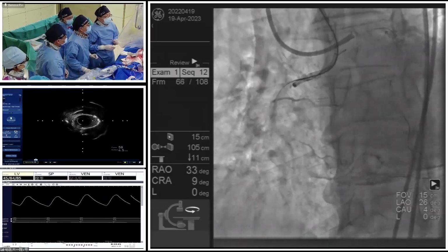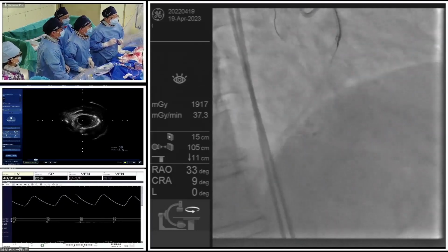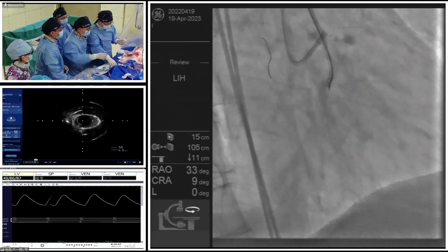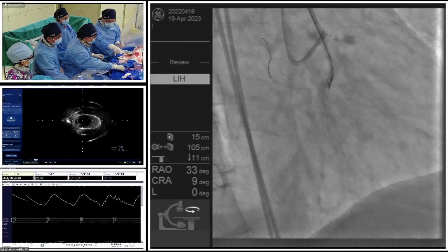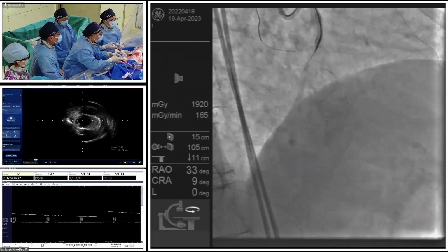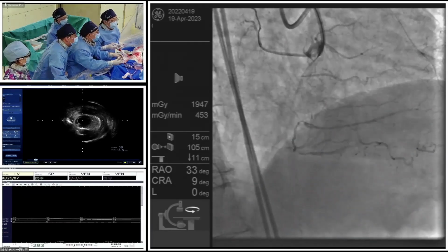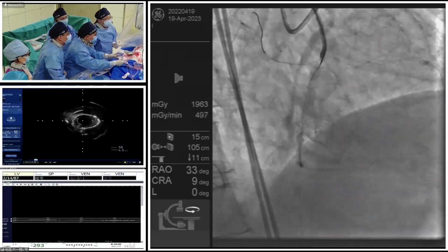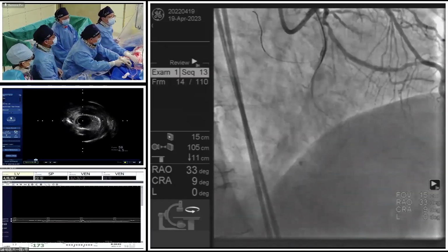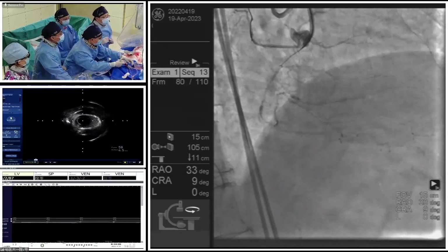And also in our center, under the leadership of Professor Lee, we make full use of CT angiography images, like this case's 3D CT angiography reconstruction, for the strategy and the details of the plaque. There is also one unique technique called CT angio FFR, which was created by our team.